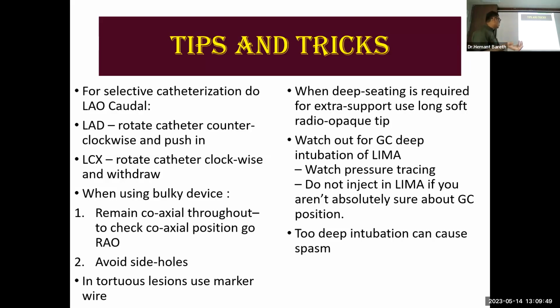And clockwise and slight withdraw, you might get circumflex. And counterclockwise and push, you might get LAD. So this is how you selectively hook LAD.